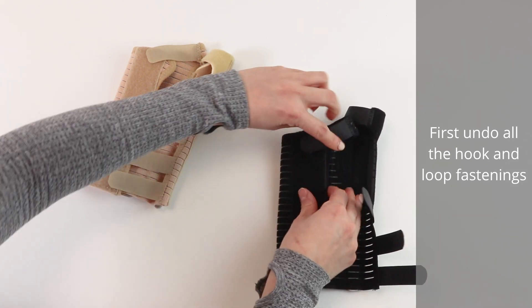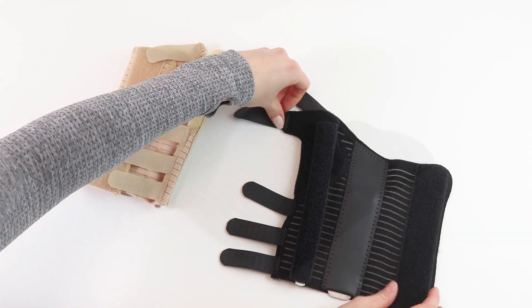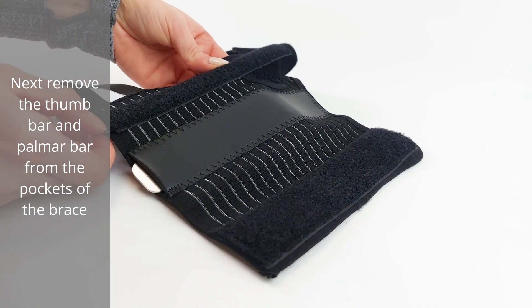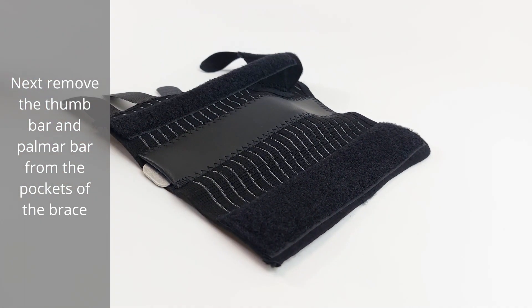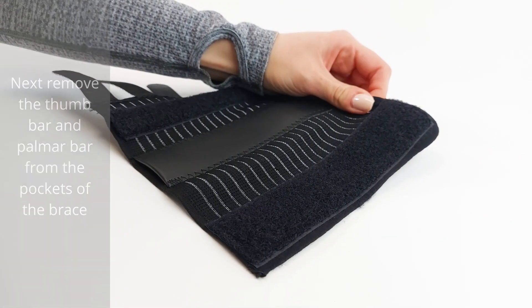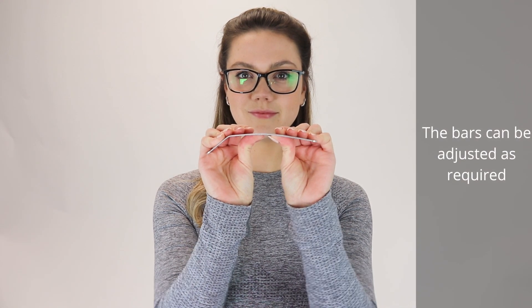Next, remove the thumb bar and palmer bar from the pockets of the brace. The bar can be adjusted as required.